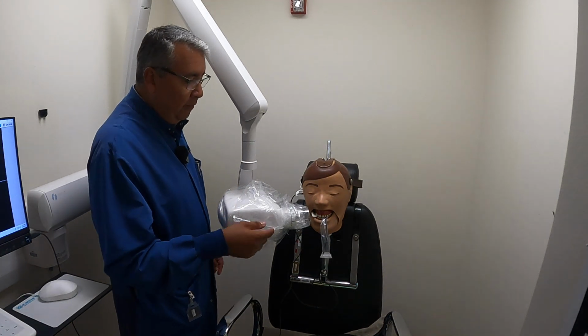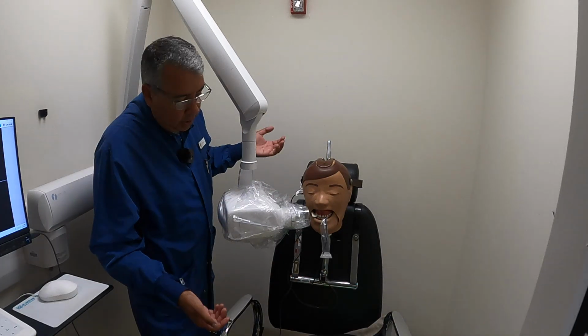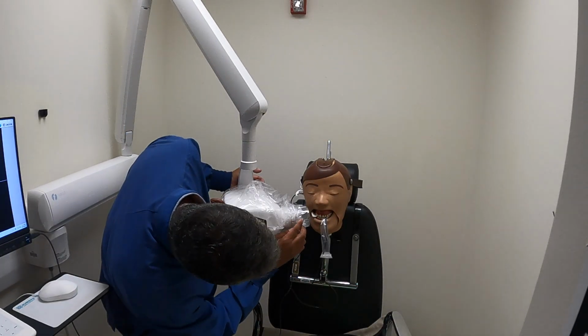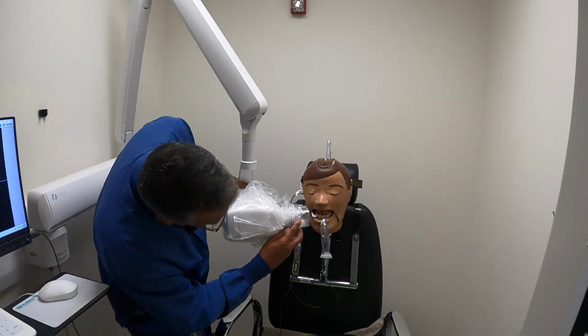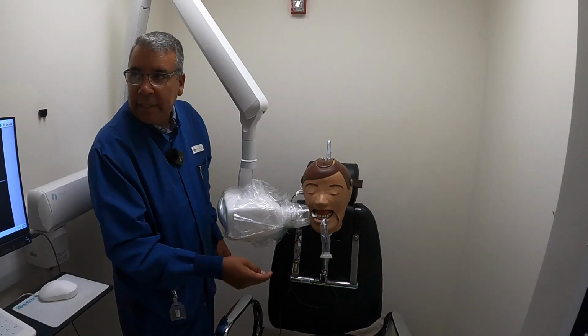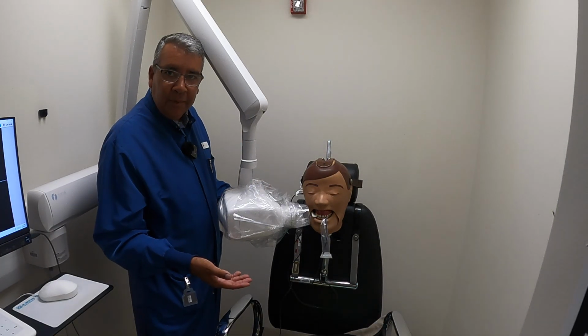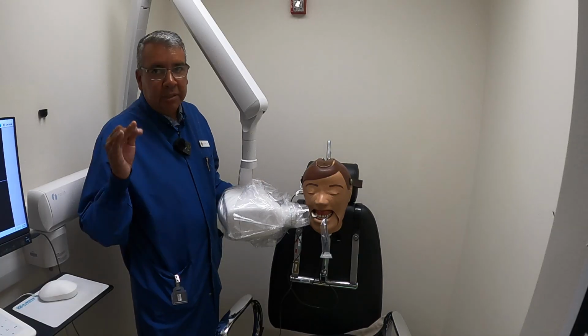I just cover the film from right to left. Now I want to make sure I'm not too high and not too low. I'm going to line this up with the bite wing tab, the bite of that patient, same thing. So I'm not too high, I'm not too low. That's it. I've just done 3 things.